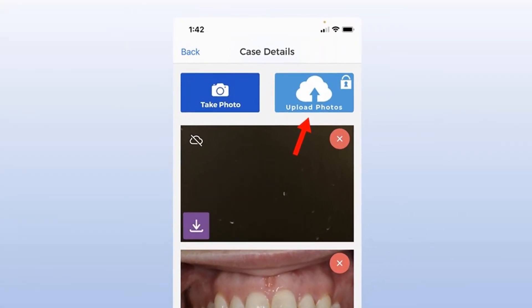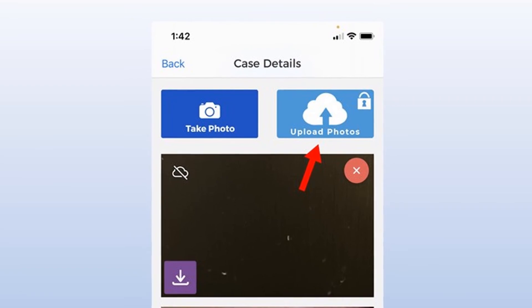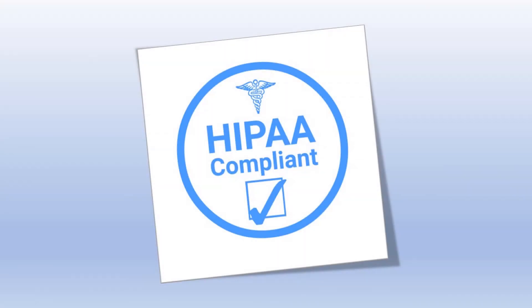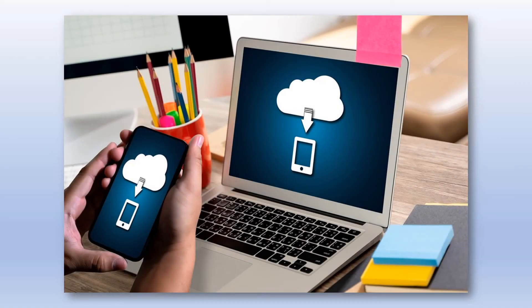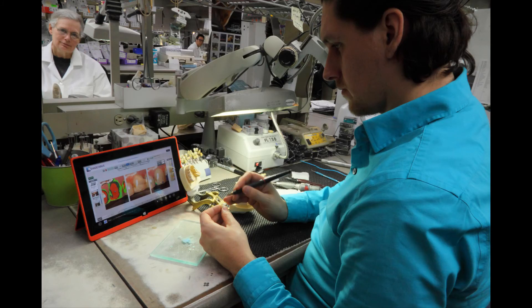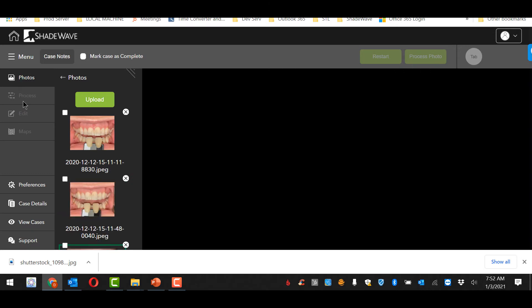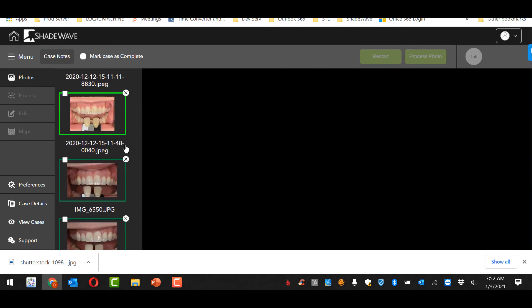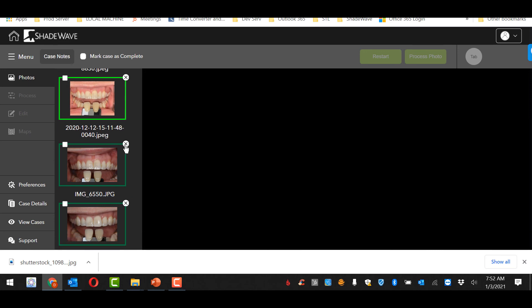Once you're satisfied, say 'upload' or push the upload button. ShadeWave Mobile is HIPAA compliant and secure. Your pictures always go to your cloud account and to your lab if they were chosen. Importantly, the photos do not stay on your phone, but you have access to them on your PC with the same credentials.